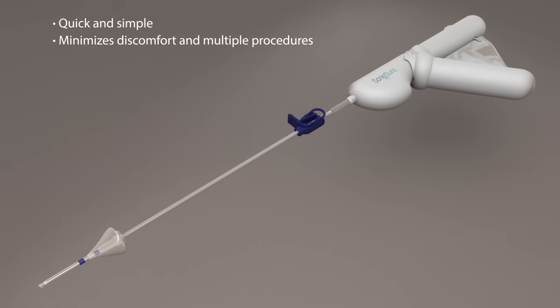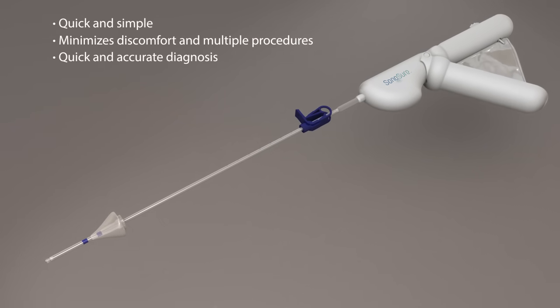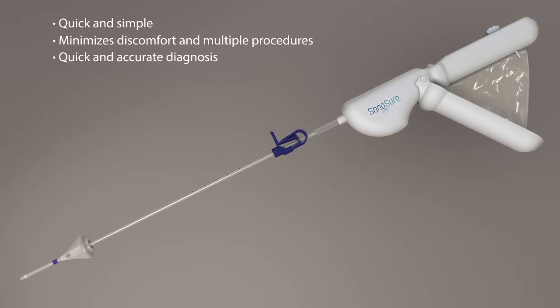In one procedure, the Sonosure allows the physician to quickly and accurately diagnose potential causes for abnormal uterine bleeding and triage patients for appropriate therapeutic procedures.